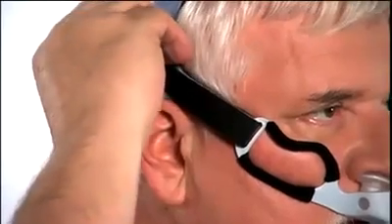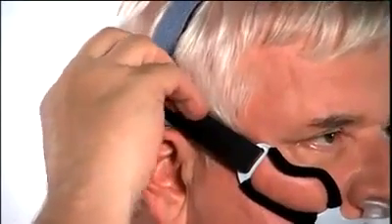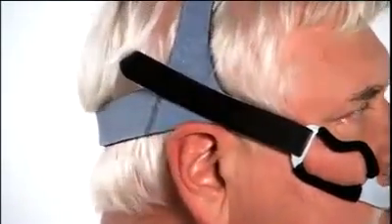Evenly adjust the side straps at the same time by pulling the fasteners off of the headgear and adjusting the length of the straps. Reattach the fasteners when the cushion fits snugly in your nostrils and the mask and headgear feel comfortable.